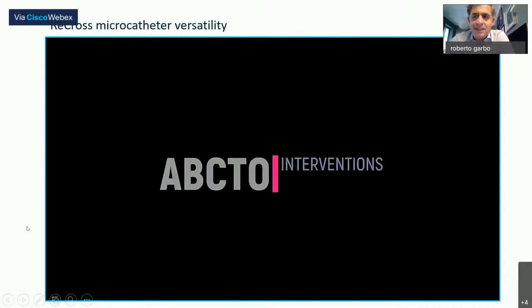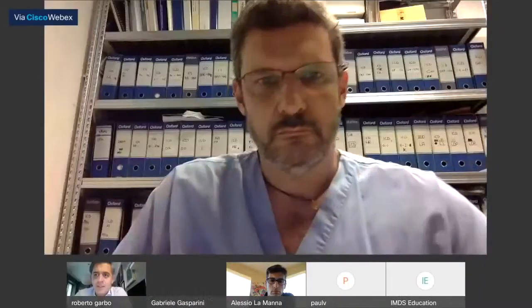It is very important. So, I can go on with this video by Gabriele. Can you explain another case of this utilization of Recross?